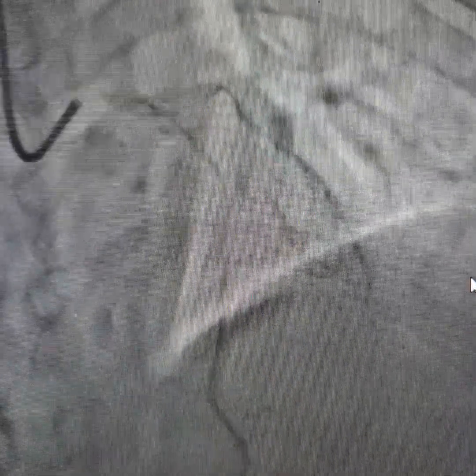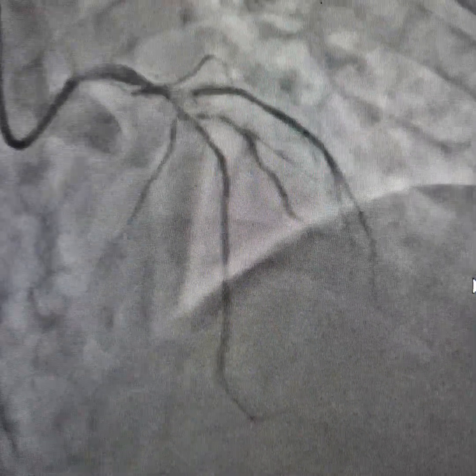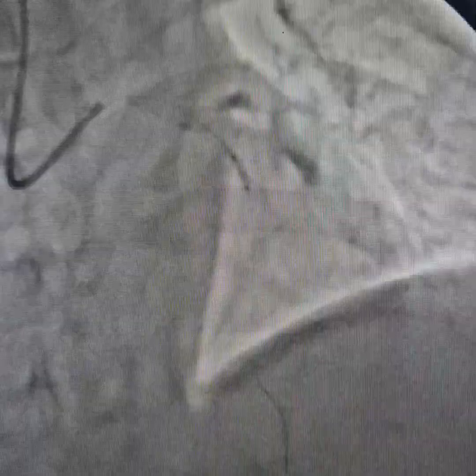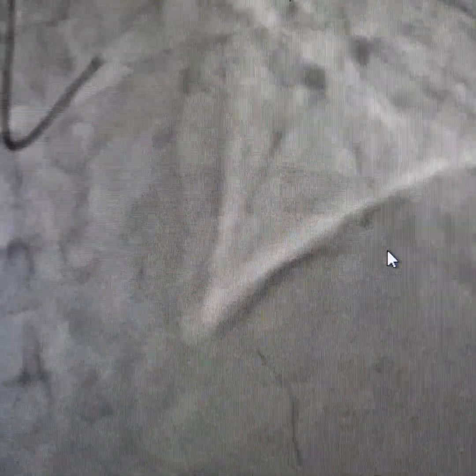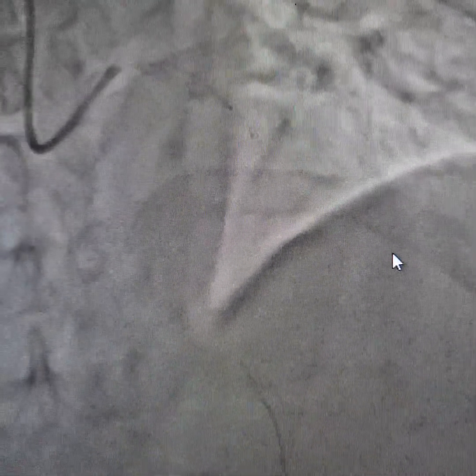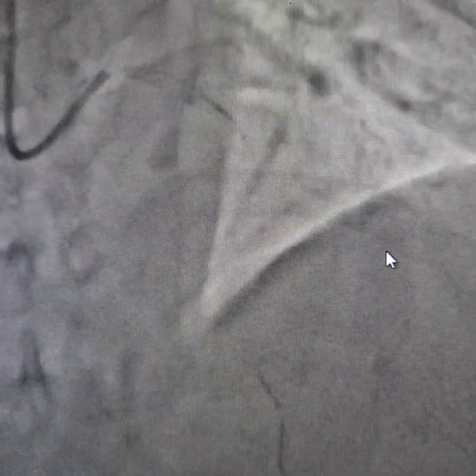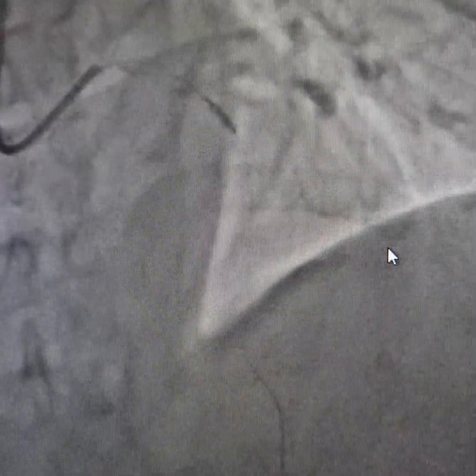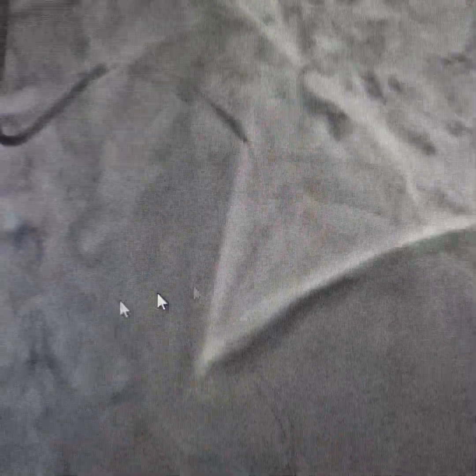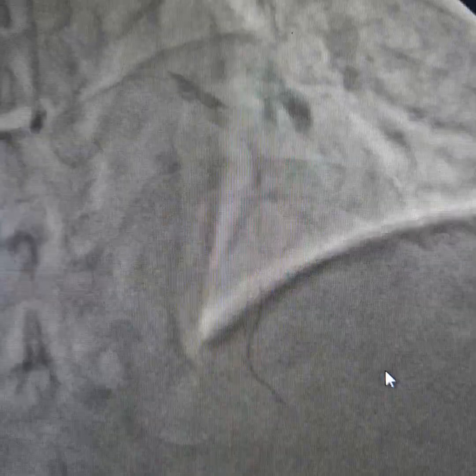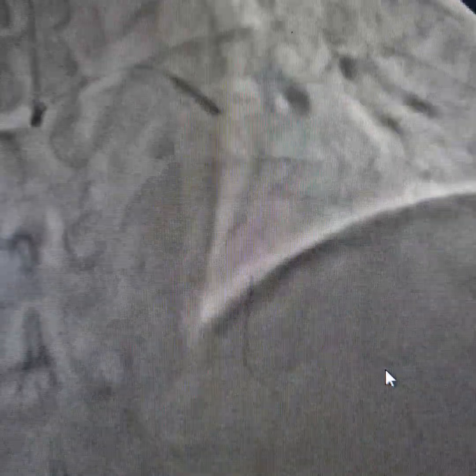So we have tried to upsize the balloon, taking a smaller balloon and going down. I am taking a 2.25 mm balloon and just pre-dilating it, doing some pre-dilatation. This one was actually the 2.5 mm balloon.